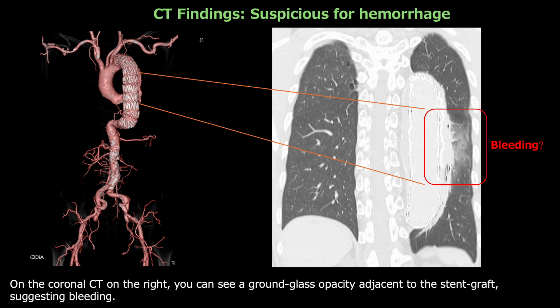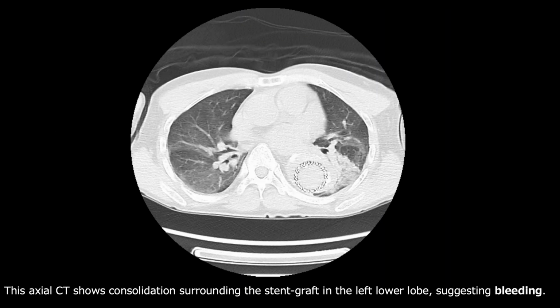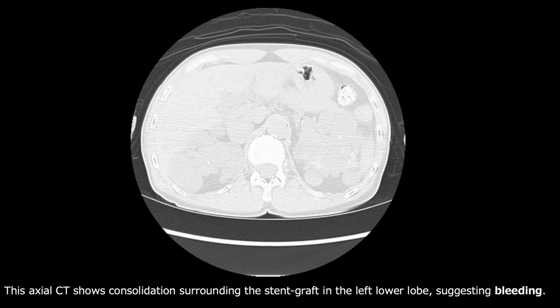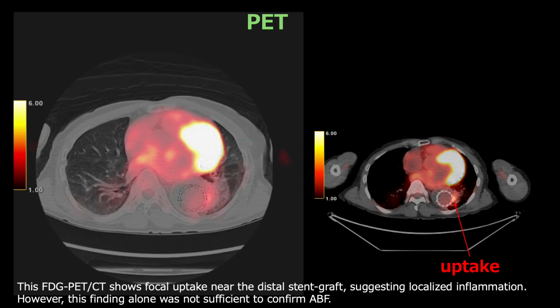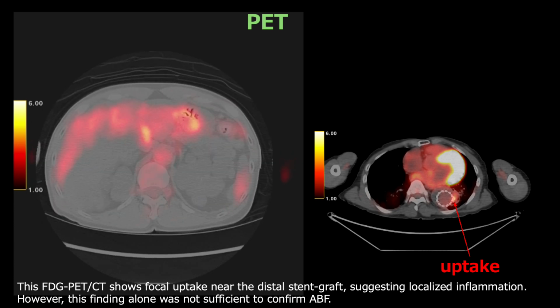On the coronal CT on the right, you can see a ground glass opacity adjacent to the stent graft, suggesting bleeding. The axial CT shows consolidation around the stent graft in the left lower lobe, suggesting bleeding. This FDG PET-CT shows focal uptake near the distal stent graft, suggesting a localized inflammation. However, this finding alone was not sufficient to confirm ABF.